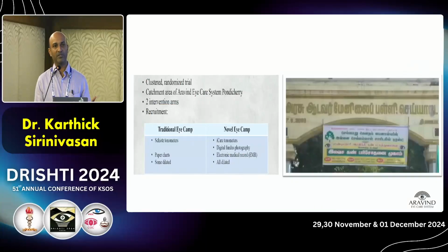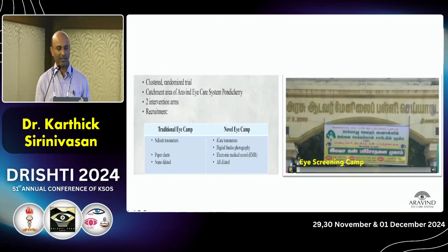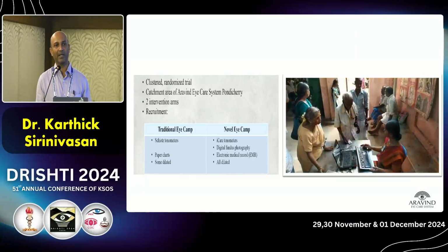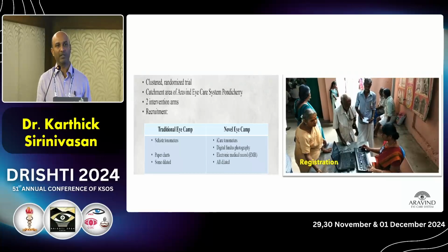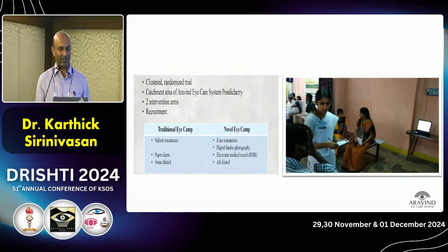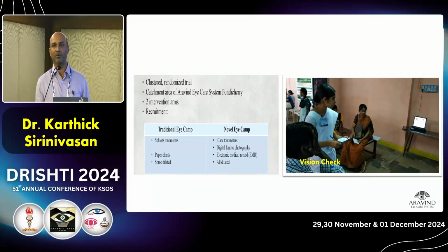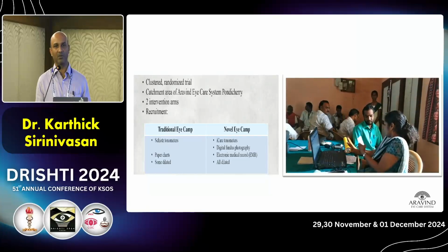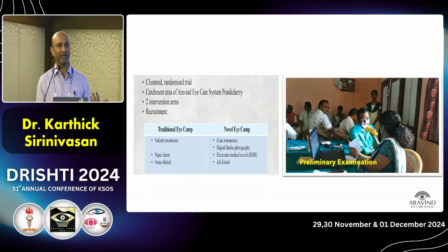So this was a setup where we used teleconsultations at the localized centers, which is a virtual center. Then we thought about where else we can do mass screening. In a traditional eye camp, we generally go there and check the patients. We majorly conduct only screening camps for cataract. We do not think about any other implications of retinal posterior segment disease, no glaucoma, no retinal disease. We just pick up the cataract and come back home.